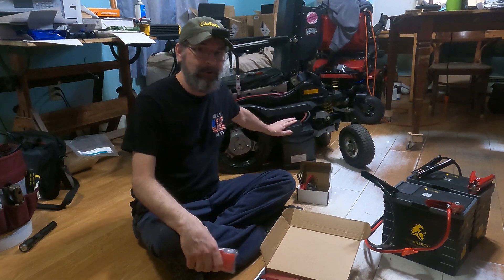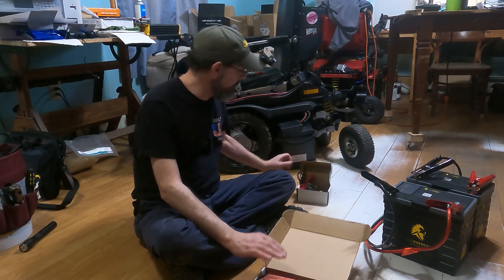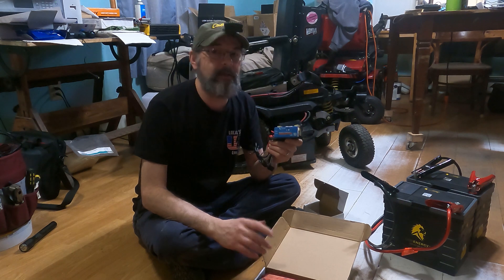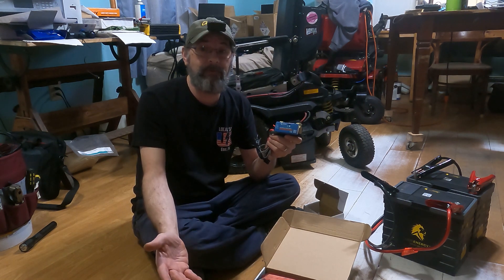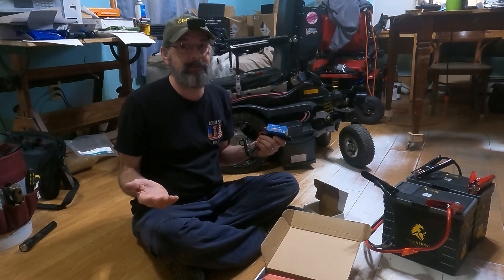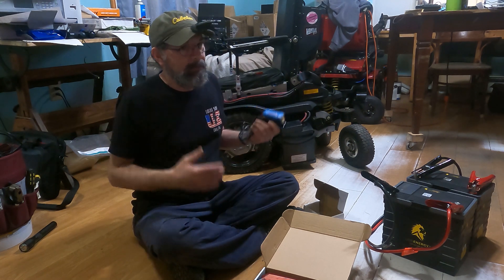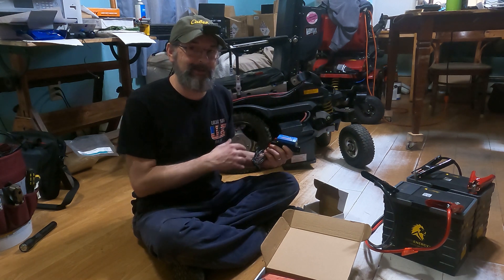Over here we have the wheelchair we're putting the batteries in — it currently has a lead acid battery, which I've dropped down. We're also putting in a shunt so Tom can use an app on his phone to track battery levels and how much time he has available, so we can track the improvement versus lead acid.